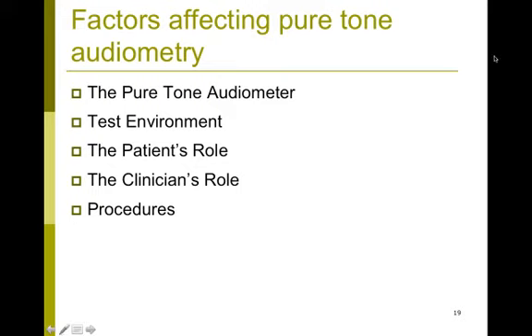So here are the variables that can potentially affect your pure tone audiometry results. The pure tone audiometer itself, the test environment, the patient's role, the clinician's role, and what kind of test procedures we are doing.